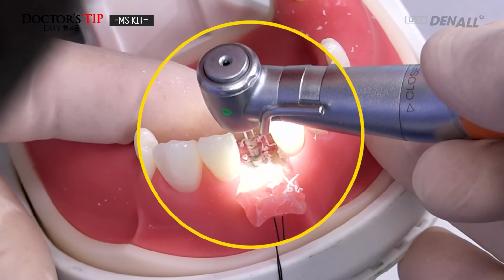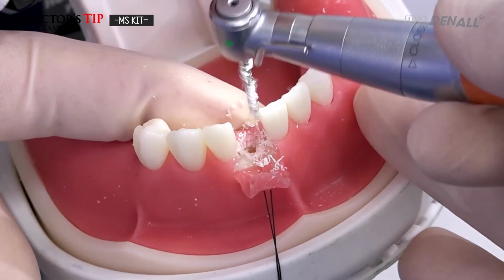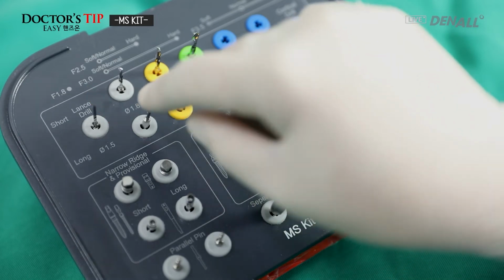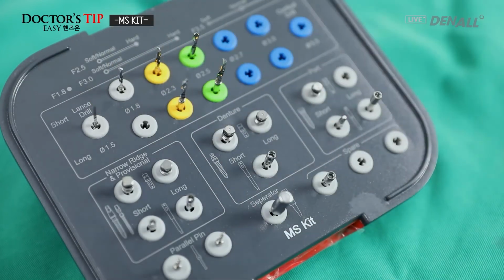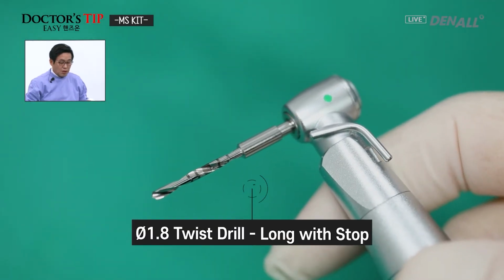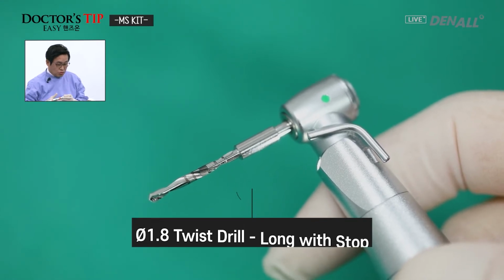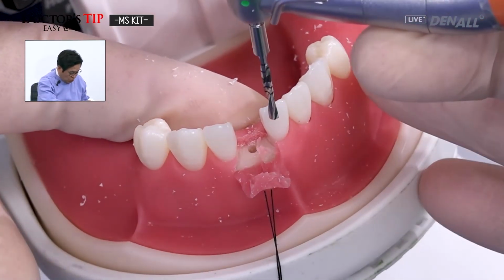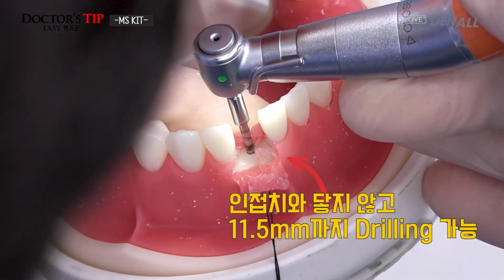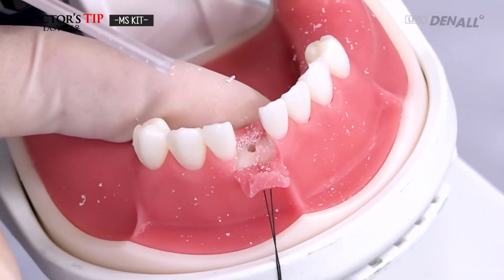If it's a short drill, there could be interference from adjacent teeth, and if you therefore cannot go to the full length, then you change to the long type, the long shaft drill. Same diameter, use the longer version. So it's a long one with stop. Again, because there could be interference in the mandibular anterior, you use the longer version of the drill, sufficient to go up to 11.5 millimeters. So I have it drilled up to that level.